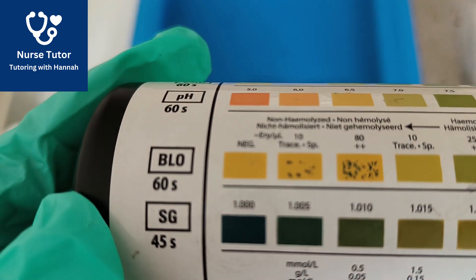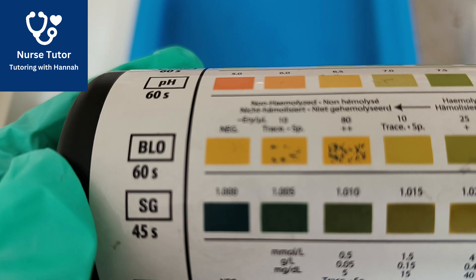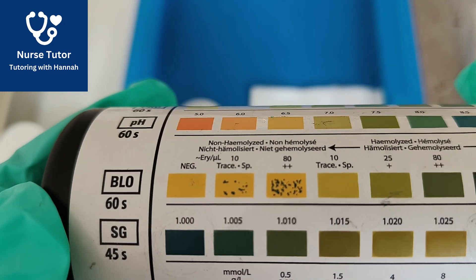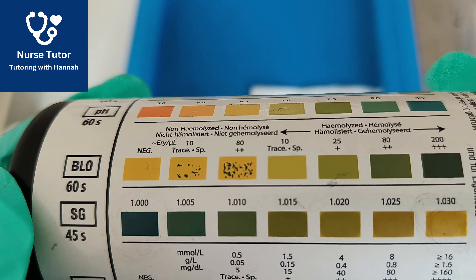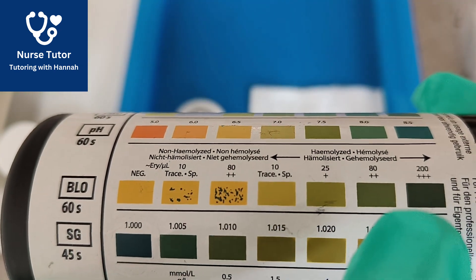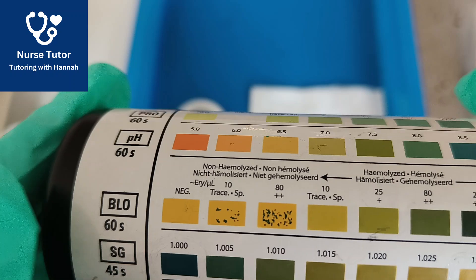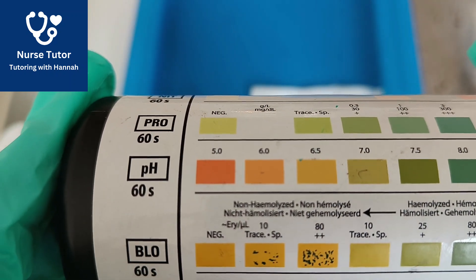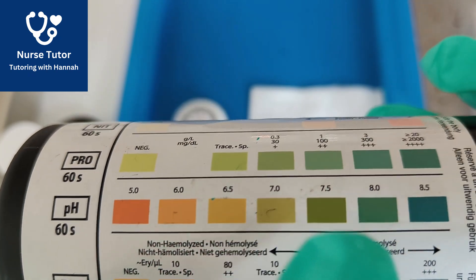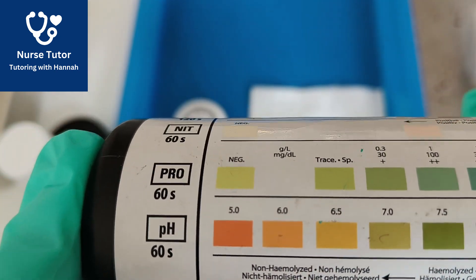Now we're on to our 60-second readings — there are four readings we can take at 60 seconds, so we read those one after the other. Blood is read at 60 seconds; it should be negative and yellow if there's no blood, going up to dark green the more blood is present. Straight after that we can read the pH at 60 seconds, and we match the colour to get the pH value of the urine.